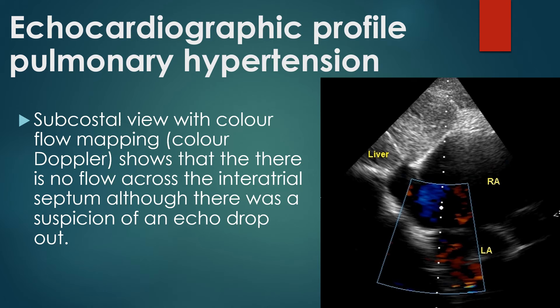Subcostal view with color flow mapping shows no flow across the inter-atrial septum, although there is a suspicion of an echo dropout. There may not be any significant flow across the inter-atrial septum even with an atrial septal defect if right atrial pressures are elevated and equal to the left atrium and the compliance of the right ventricle is reduced due to hypertrophy. In such situations, a transesophageal echo may confirm the presence of an atrial septal defect; in some cases, cardiac catheterization and angiography may be required in addition.